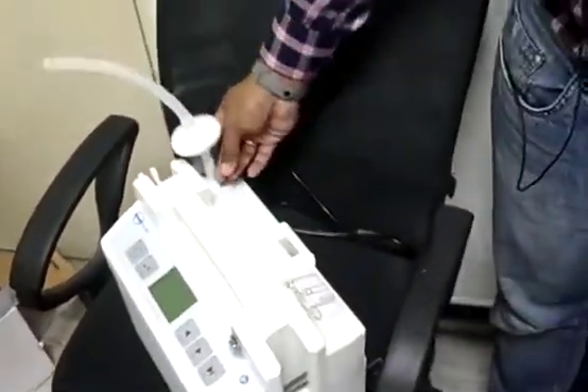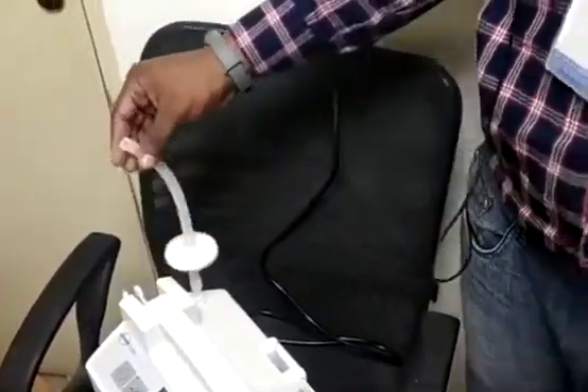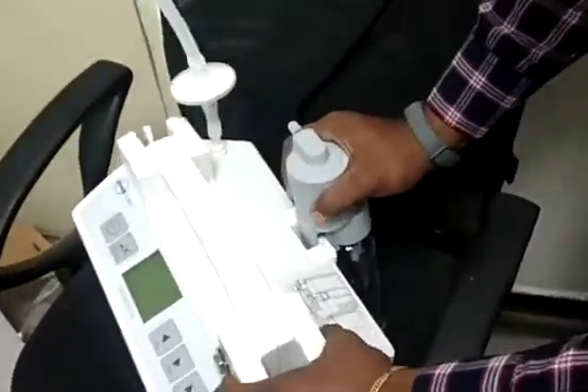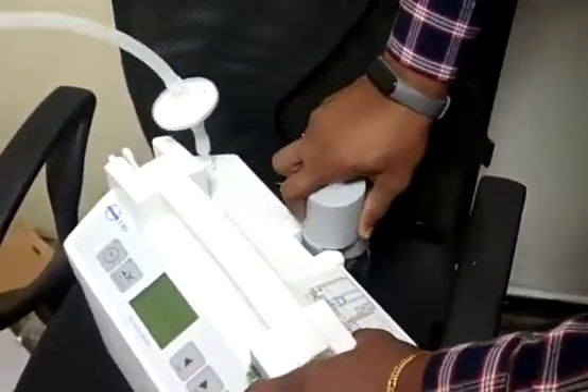Then from this machine, the tube will go from the filter to the safety jar. This is called the safety jar. We are going to connect the safety jar to the back side of the machine. You can see this slot here — this slot has to be fixed in the machine. Just press it, and once you press it, automatically it will get locked.